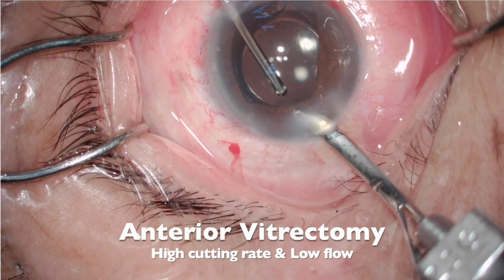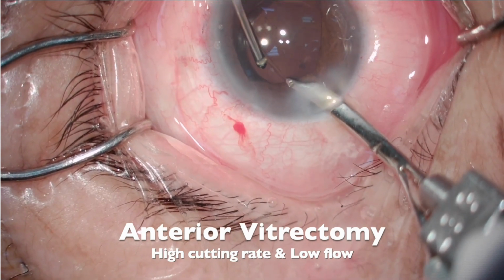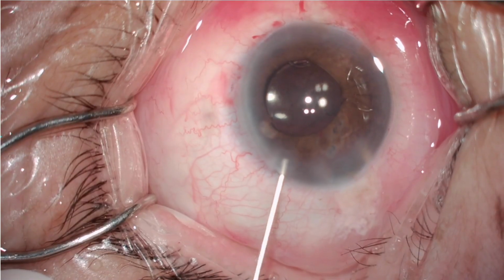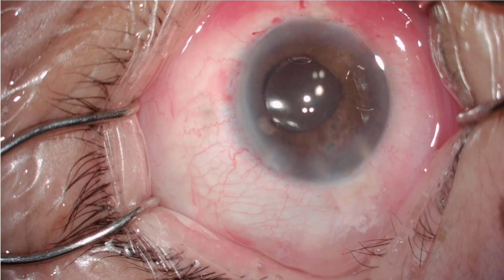Vitreous prolapse was noted after I removed the OVD. Manual anterior vitrectomy was done with a higher cutting rate and low flow. Miostat was injected to control the pupil at the end.